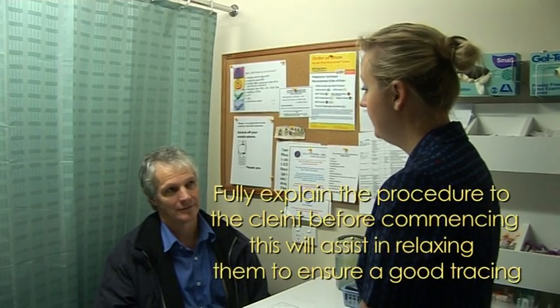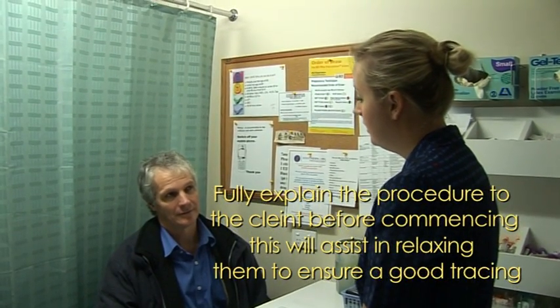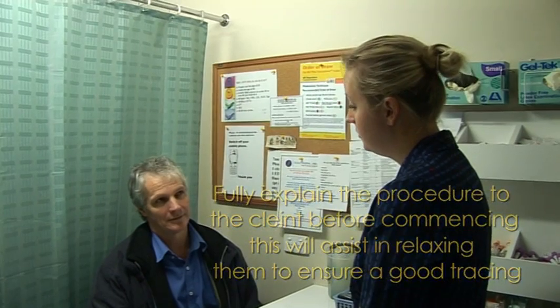Good morning. Doctor has requested that we perform an electrocardiogram today, otherwise known as an ECG. This is a simple tracing of your heart muscle. It involves me sticking some electrodes on your chest, your wrists and your ankles, laying up on the bed for a short amount of time.